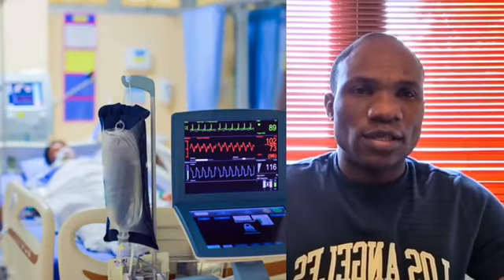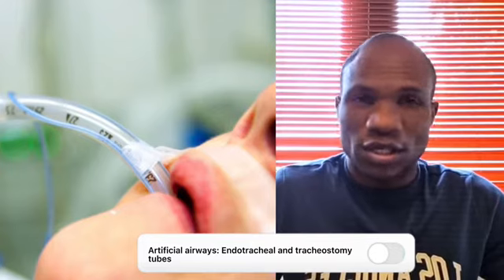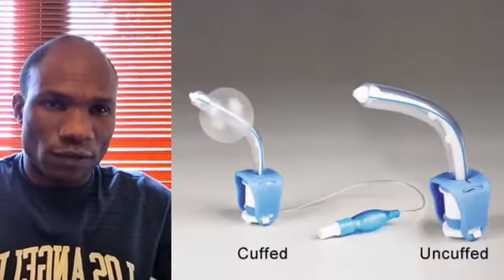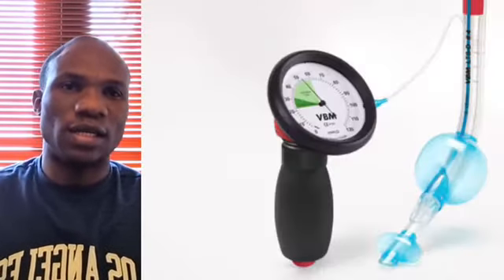In the ICU, we give ventilatory support to patients, and we do this through the intervention of artificial airways. Some of the artificial airways, the commonly used ones in the ICU, are the endotracheal tube and tracheostomy tubes. Now, these tubes come with cuffs. Some are cuffless or uncuffed, but I'm talking about the ones that have cuffs. The cuffs are like a balloon located at the tip end of the tube.